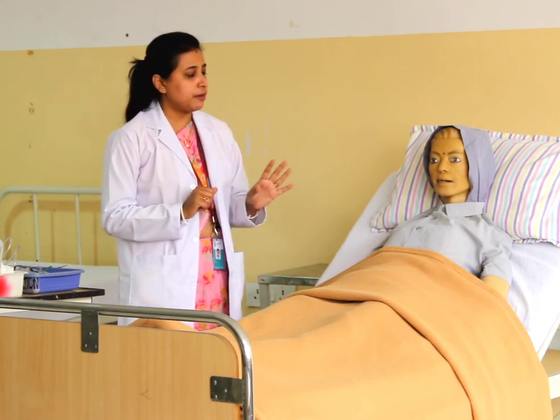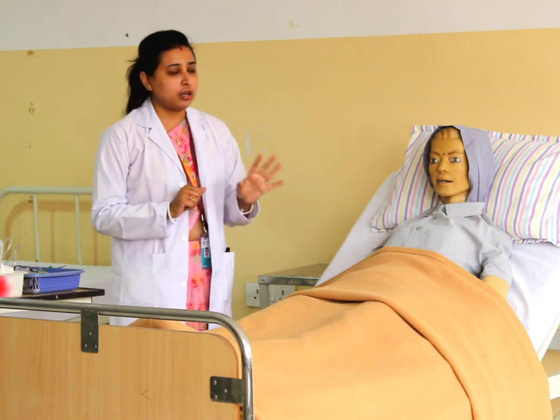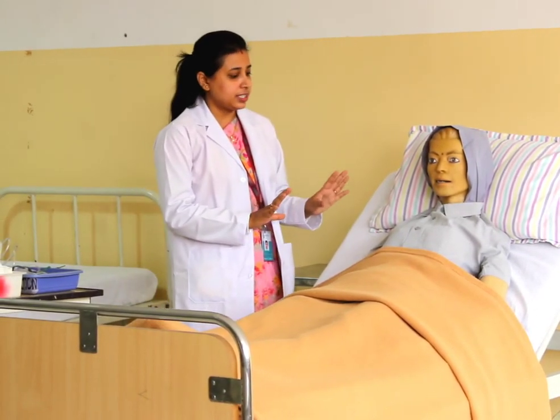To perform nebulization therapy, first wash your hands — medical hand washing. Next, explain the procedure to the patient, including the steps, the therapeutic effect, and the side effects. Then give the patient a comfortable semi-Fowler's position to expand the lungs so that medication will disperse properly.